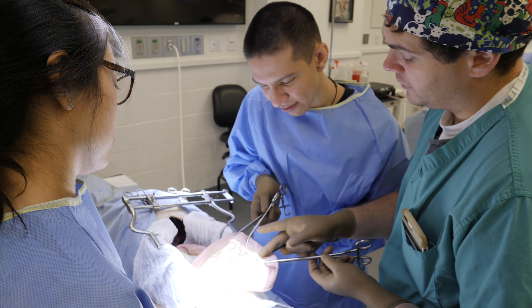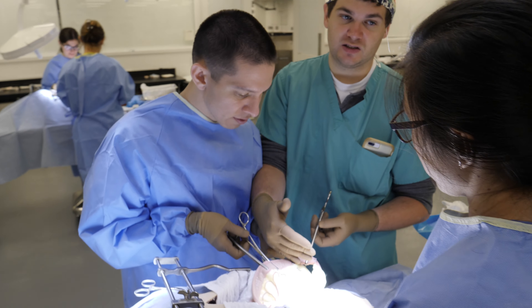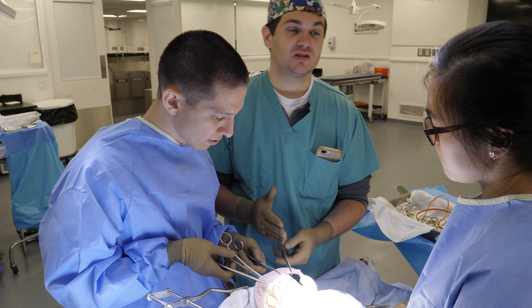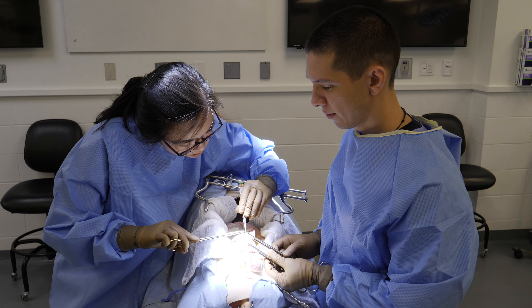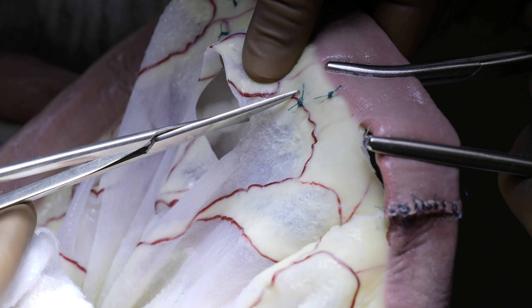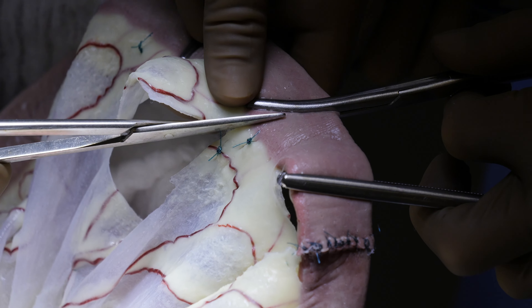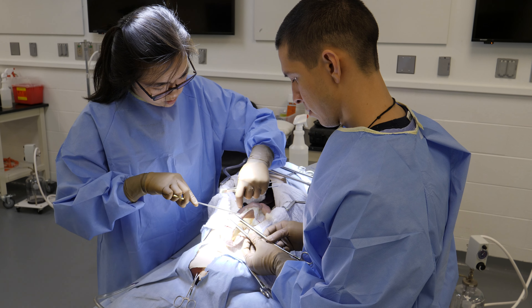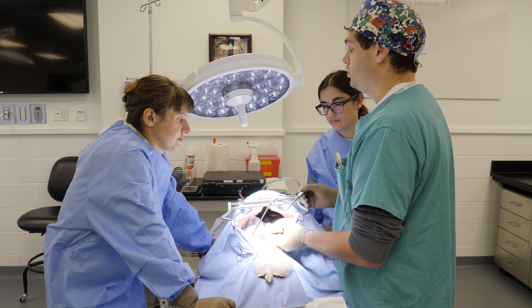We want to make our cut away from the mesenteric surface, on an angle — we don't want to cut straight across because the tip's blood supply will be poor. The clamp is placed appropriately; you want to place a suture almost at the base of the intestine, ligating so it's not bleeding. It can be a very prominent artery that'll spurt at you, so they can be a pain.